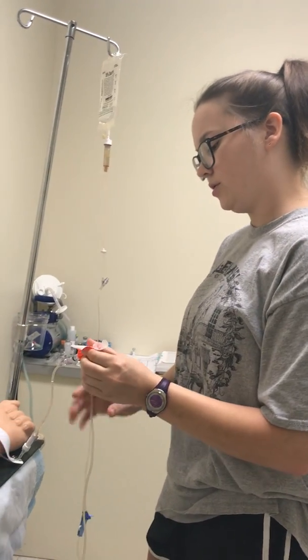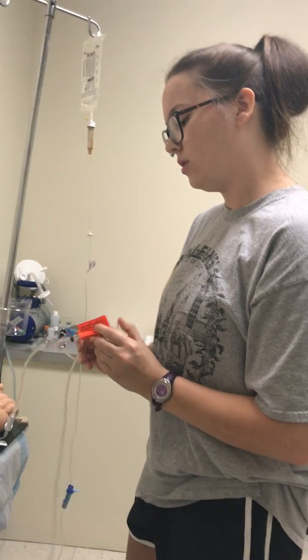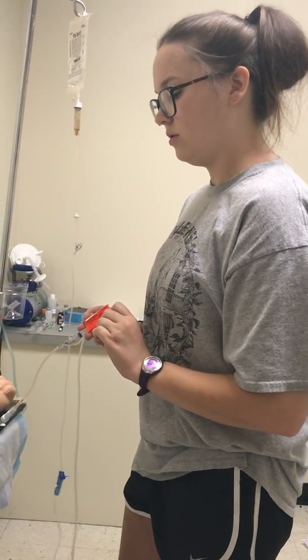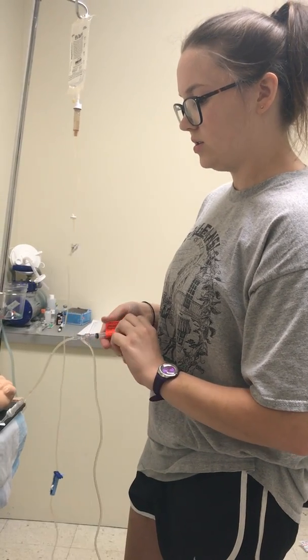Okay, for the last dose, gonna kink the tubing one more time. Administer the rest. Now unkink it. Assess the site.